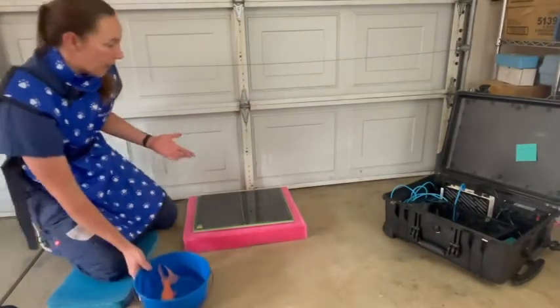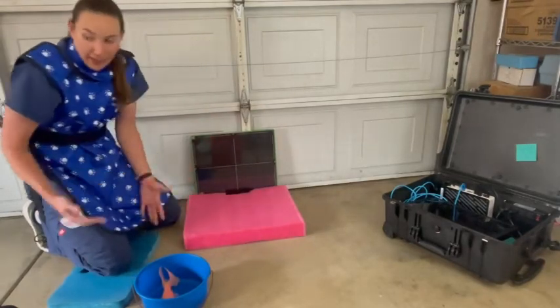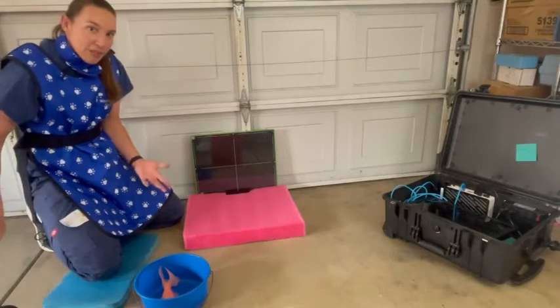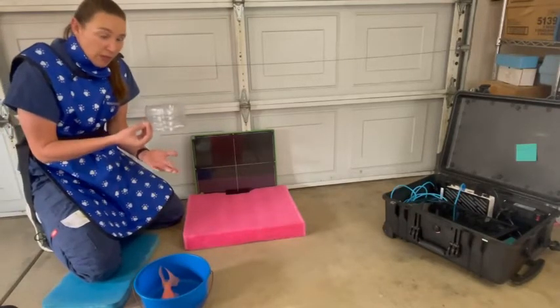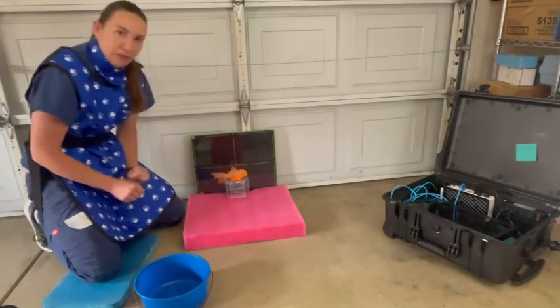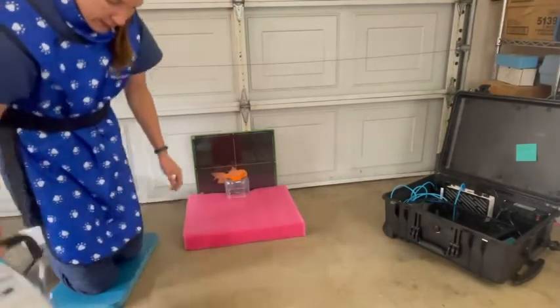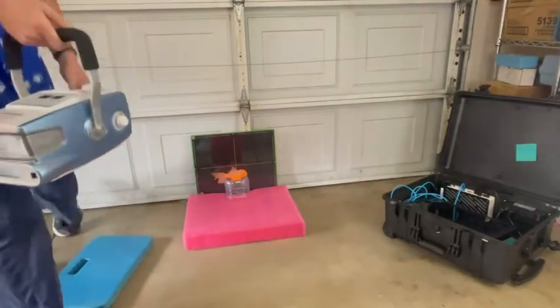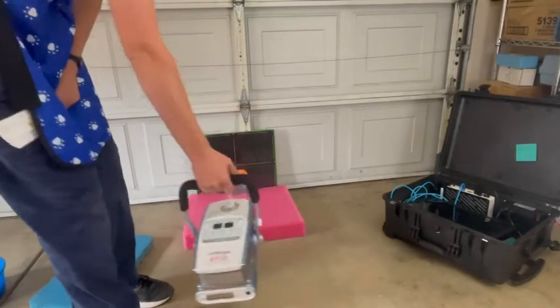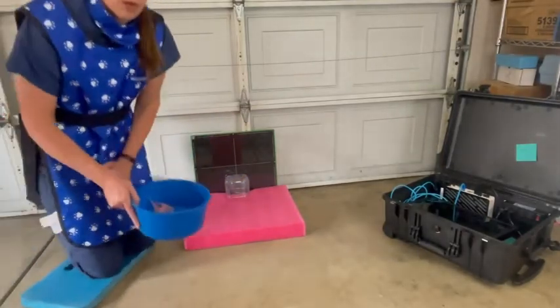For the lateral view, this is especially important in fancy goldfish — we have to take this upright. A lot of the time the fish don't really sit upright too well, so we have a special magical one-liter water bottle cut in half that has a nice little divot up here that goldfish just sit in perfectly — it was made for them. So once again they're anesthetized, sleeping fish. We get our rig ready, put it in place — there would be little red dots had we turned this on — take the shot.